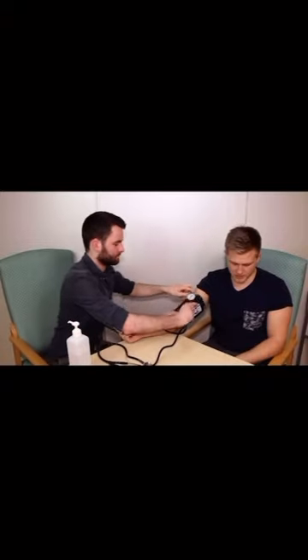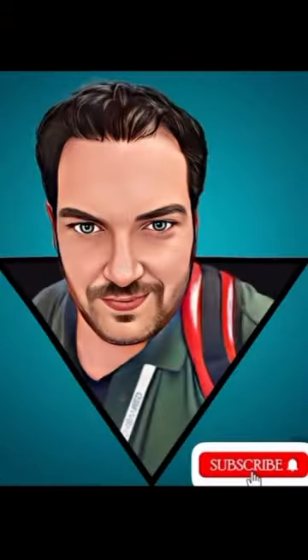Continue to deflate the cuff. If the patient's blood pressure is outside of the normal range, you should repeat the assessment on the same arm after a few minutes.